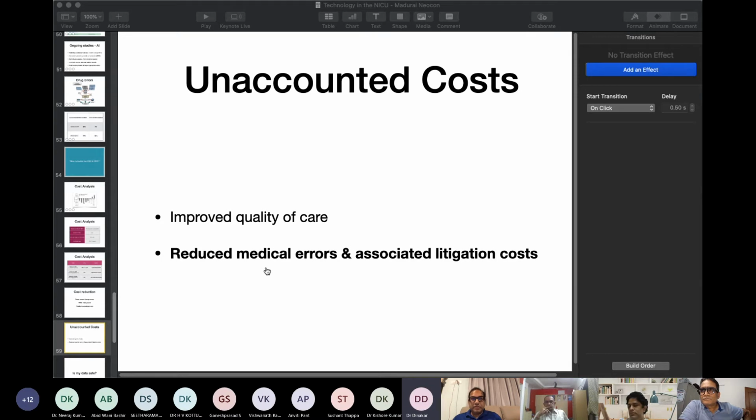The weight and the bulkiness. Just now Murugan was telling there are so many instruments, and that syringe pump docking system is covering almost all of that. If you put the infusion pump, you cannot go almost 4 feet that side, this side. It will occupy almost 1.5 to 2 feet. If you add a syringe pump and infusion pump once again, it will occupy almost 3.5 feet, then the wires and gear.